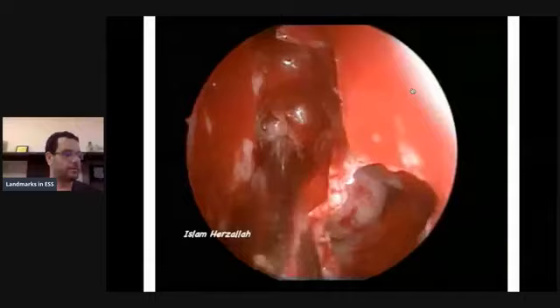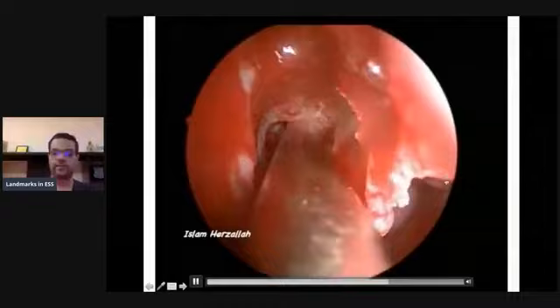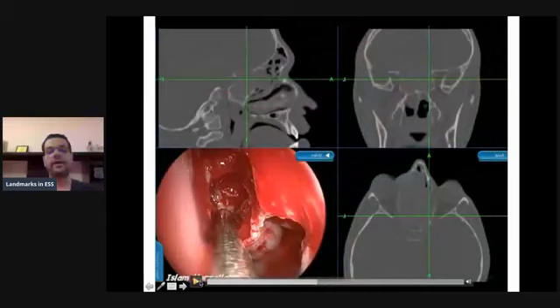So I'm now entering into the posterior ethmoid and actually opening through the posterior ethmoid while starting at the medial orbital floor. But here's one thing I also want to mention. Remember, if you go with your suction tip, instead of pointing horizontally, posteriorly, you are actually pointing superiorly, you can end up getting into the skull base. So I'm talking about using the instrument in the right way, horizontally at the level of the medial orbital floor, rather than pushing it superiorly into the skull base.